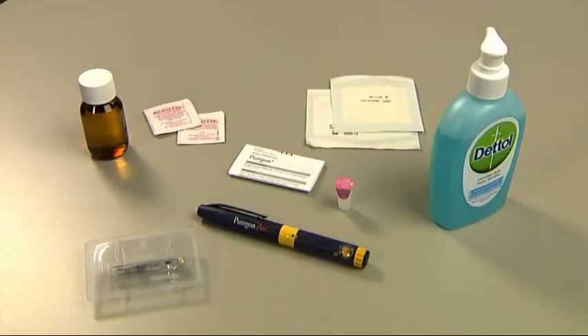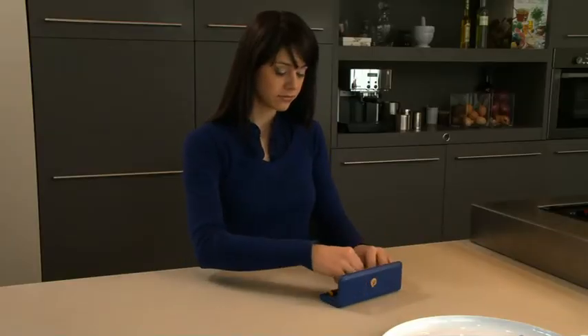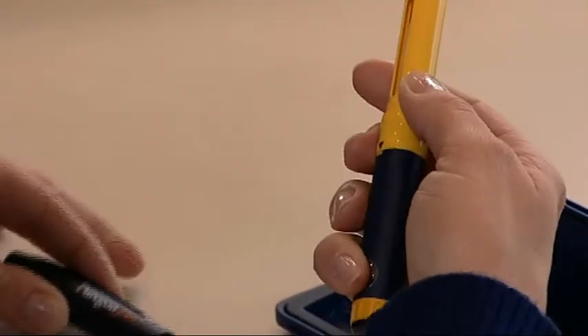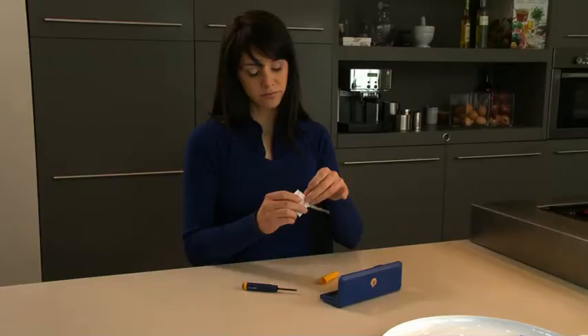At the start of your Puragon treatment and each time you need to change a Puragon cartridge, take your Puragon pen and remove the cap from the pen by gently pulling it off. Unscrew the body from the cartridge holder and put it aside. For the next step, you need the yellow cartridge holder and a Puragon cartridge.